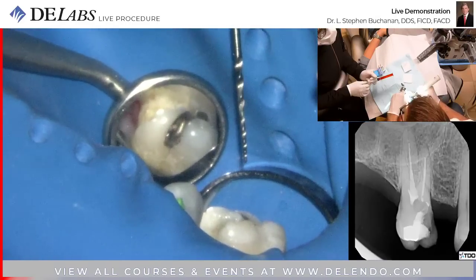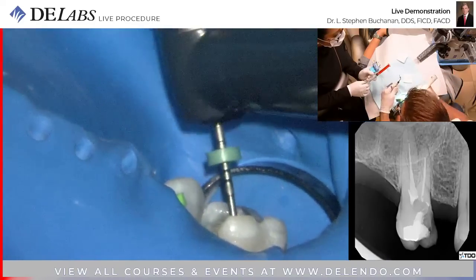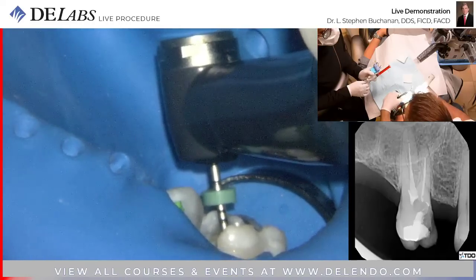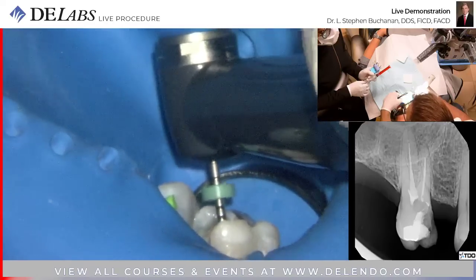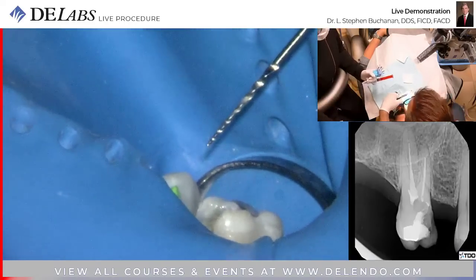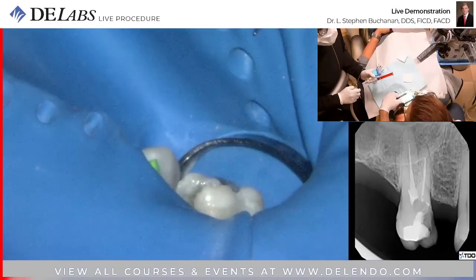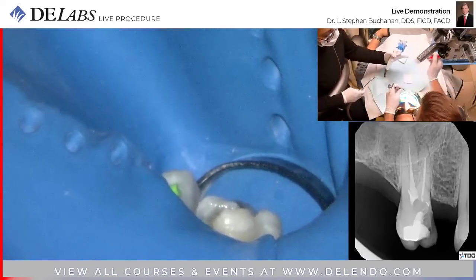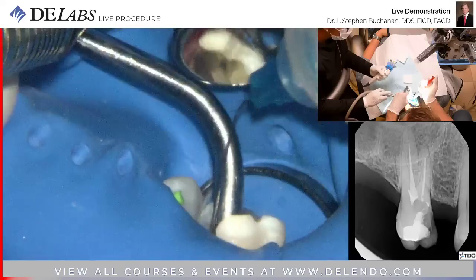Okay. The debris is not at the tip primarily. And these have landed blades, so you do put some apical pressure on it. This is advancing very slowly, but we're good there. Okay, so in the final position, we see debris in almost the very last flutes. You wouldn't expect it because we have taken a K file there, and the tip of the file was a passive pilot guide.